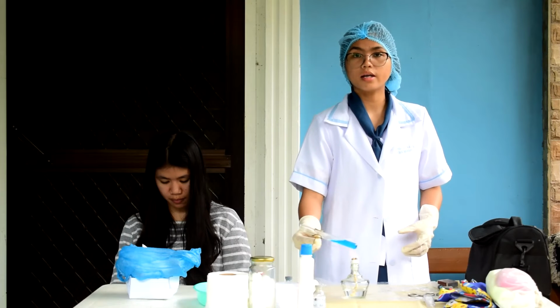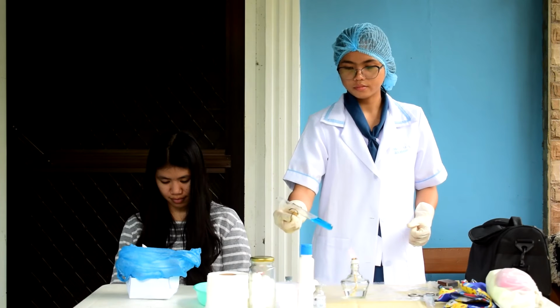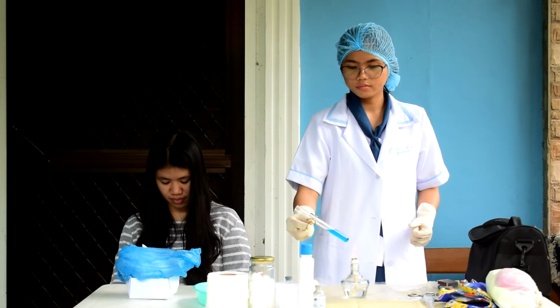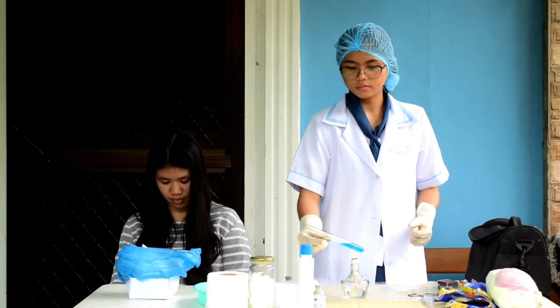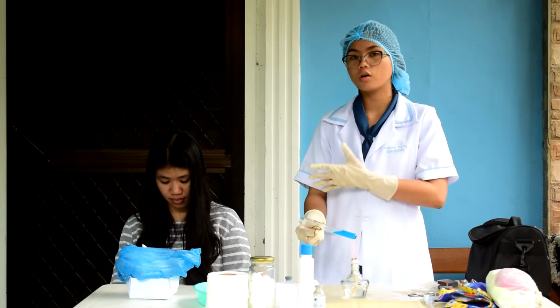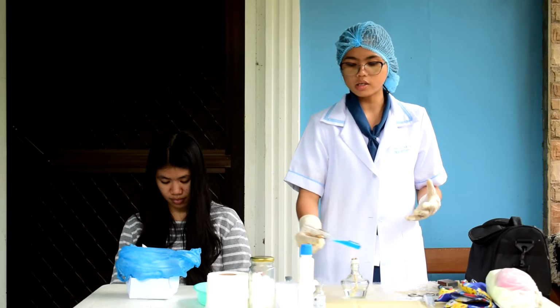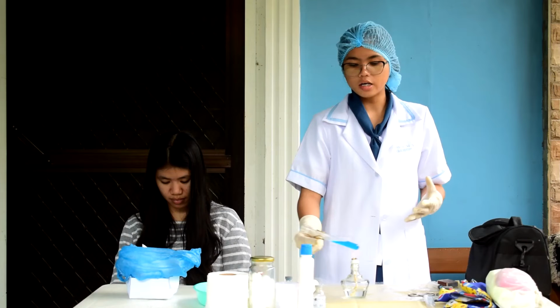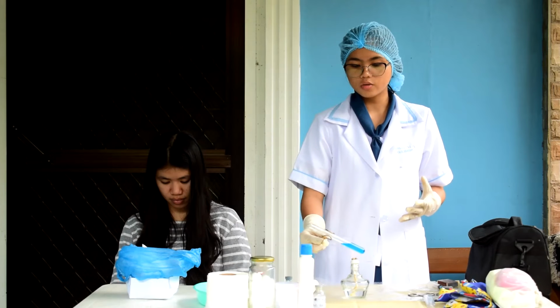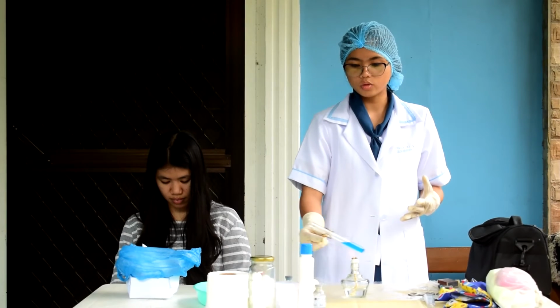So approximately 30 seconds. While you're heating, make sure that you are interacting also with your patient or with the mother, to avoid causing so much anxiety. And as you can see, when the solution is attempting to boil, you see some moisture precipitating on the test tube, then it's time to remove.